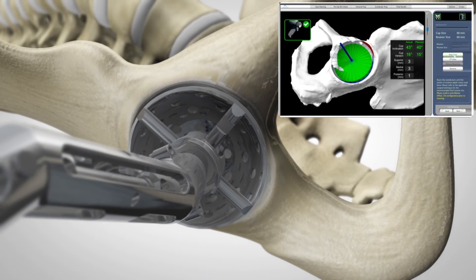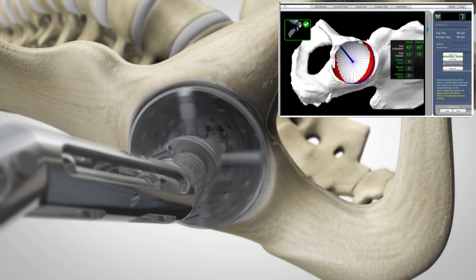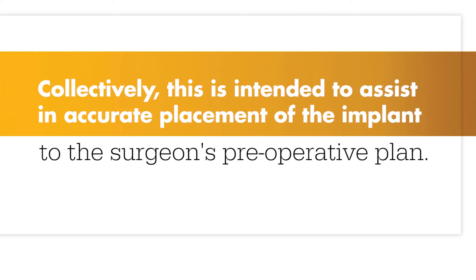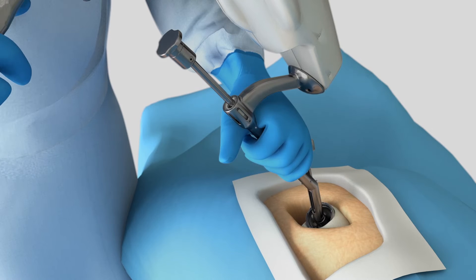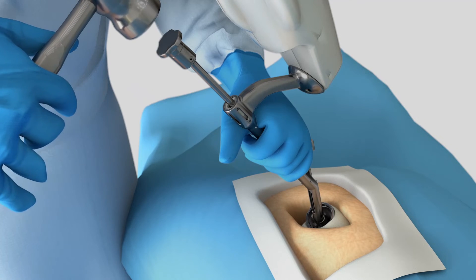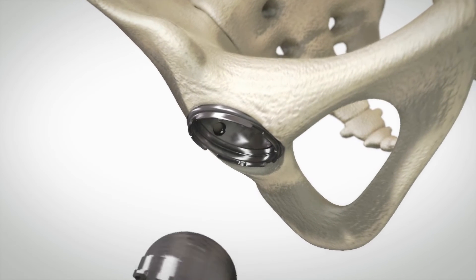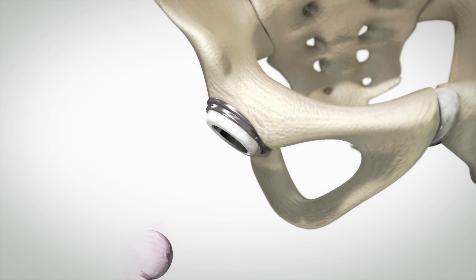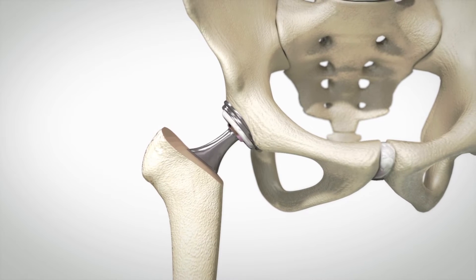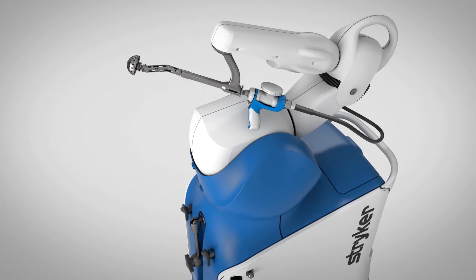And visual cues, shown in green, appear on-screen to show how much bone to remove. Mako assists the surgeon in performing controlled and accurate preparation of the hip socket. As the surgeon prepares to place the implant into its final position, the robotic arm guides the cup at the desired angle defined in the surgical plan. With the diseased bone gone, a total hip implant is inserted in the joint space. And that's how Mako Total Hip is transforming joint replacement.